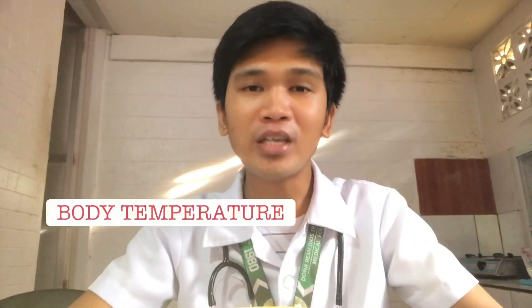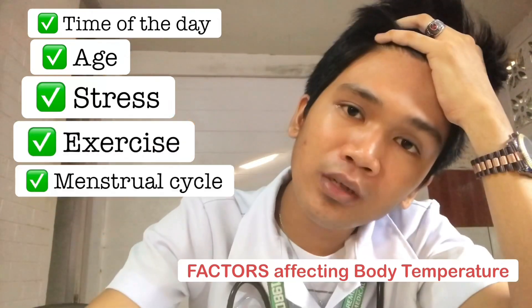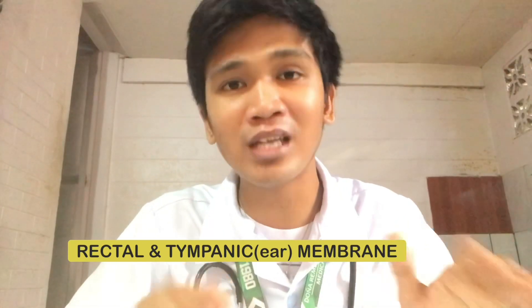Step number seven: take the body temperature. There are different factors affecting body temperature, so it is important to remember that a range of values is more representative of normal temperature. Those factors include time of day, age, stress, exercise, menstrual cycle, pregnancy, and measurement site. Regarding measurement sites: rectal and tympanic membrane temperature is the most accurate, with a normal value of 37.5 degrees Celsius; oral temperature has a normative value of 37 degrees Celsius; and axillary temperature is 36.4 degrees Celsius. We will use a digital thermometer for axillary temperature. The patient places it under the armpit, and after a few minutes we check the result.